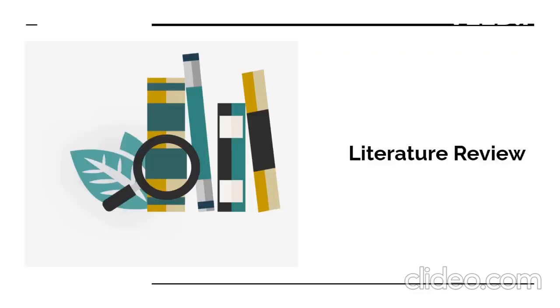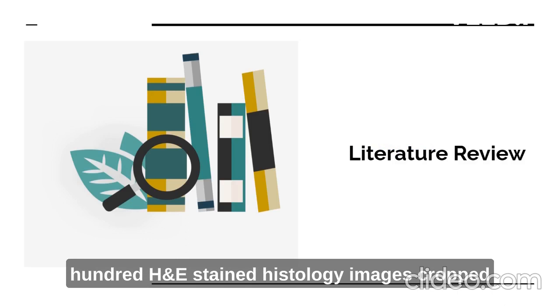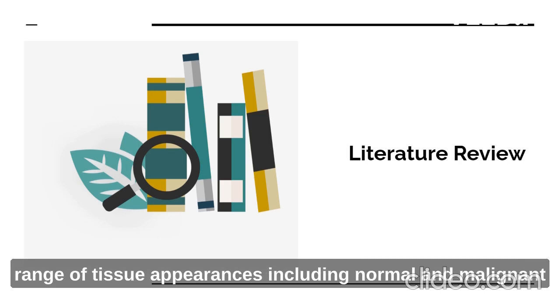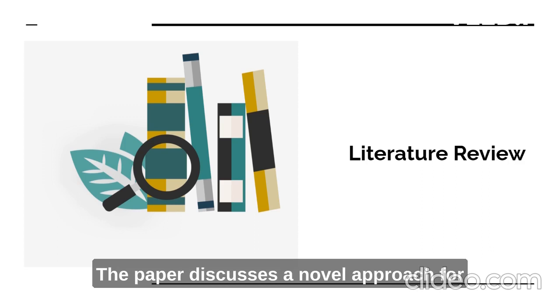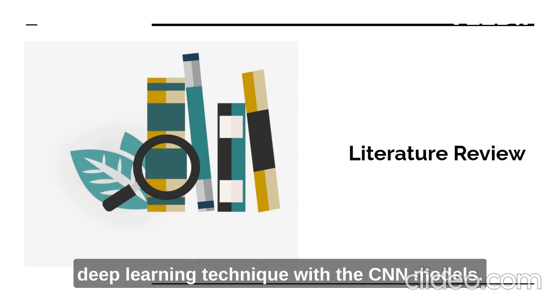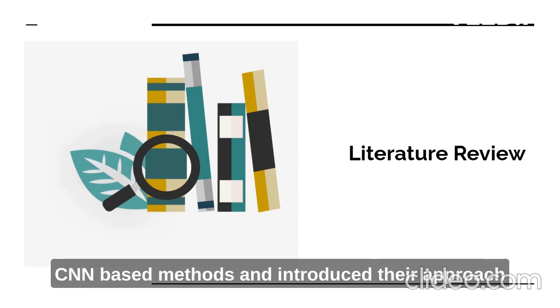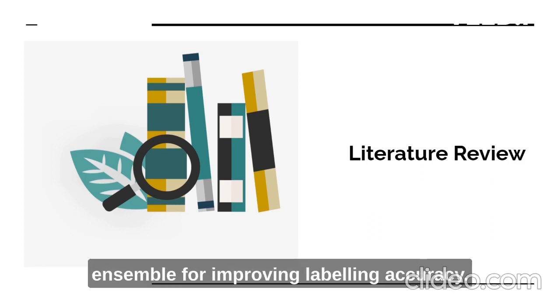For the first paper, the dataset used for evaluation consists of 100 H&E stained histology images cropped from different areas of 10 whole slide images, covering a range of tissue appearances, including normal and malignant regions, as well as artifacts. The paper discusses a novel approach for detecting and classifying nuclei in histopathology images. The proposed method utilizes a locality-sensitive deep learning technique with CNN models. The authors addressed the limitation of the standard CNN-based methods and introduced their approach, which incorporates distance-based calculations and a weighted ensemble for improving label accuracy.